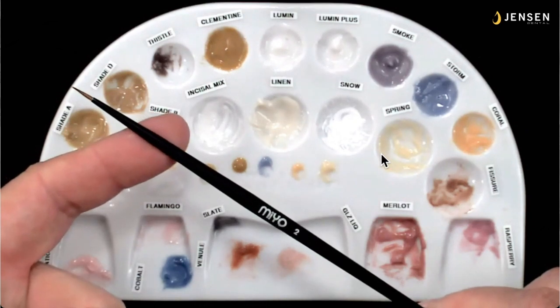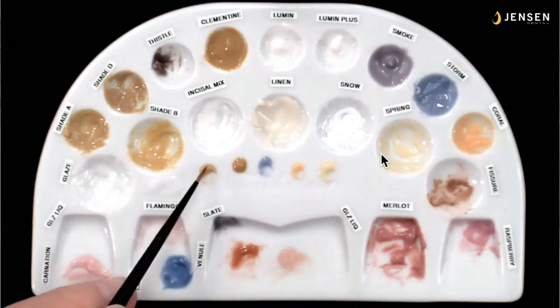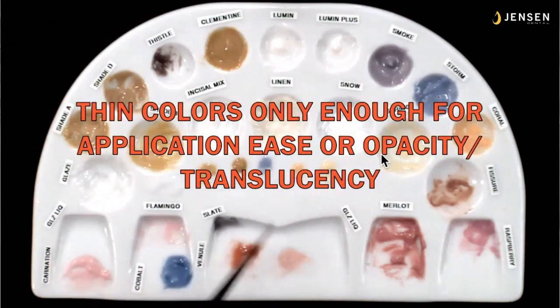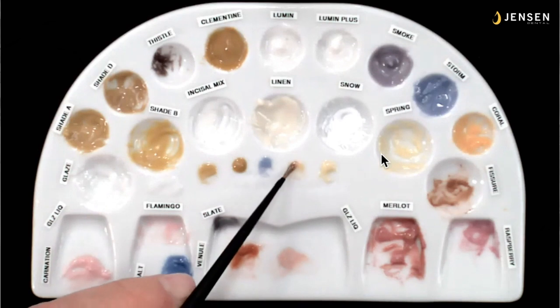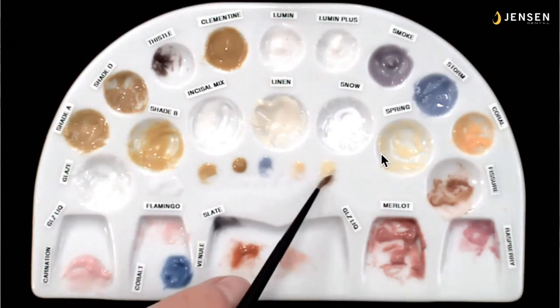So I'm going to use my MiYO number 2 brush. It's about the size of a 00 brush from an art supply. Remember, the MiYO colors do not like water because it'll make them cloudy. They'll fire okay, but you won't know what they're going to be. But the InSync paste glaze liquid will be perfect. It's just thin enough for the application ease and to make sure they're the right transparency or opacity for the job you're trying to accomplish. So there's a coral, and next I'm going to go to the spring halo. I'm not thinning these down very much. I'm just thinning them down enough to where they're not going to go on like a paste.